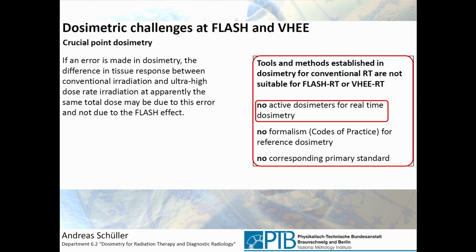So this is really a limitation for this new way of curing cancer, high dose rate flash effect. And at the present time, there are no active dosimeters, and it's really a pain because you have to rely 100% on the behavior of the machine. And we've seen before that a LINAC can oscillate or can start normally, or sometimes it drops down, then it goes again into bringing power, so you don't know what to do. And it's so powerful, this flash effect, that you really have to be careful.